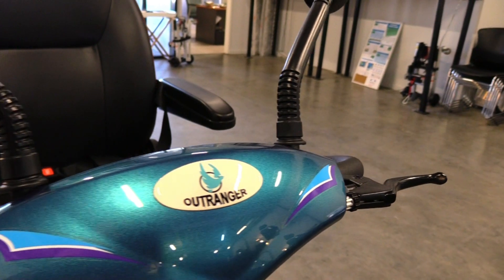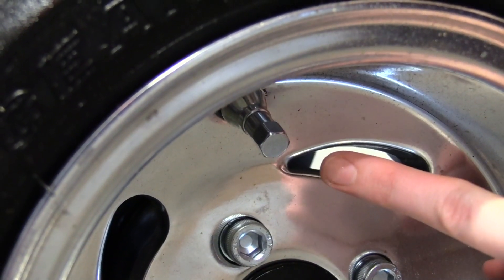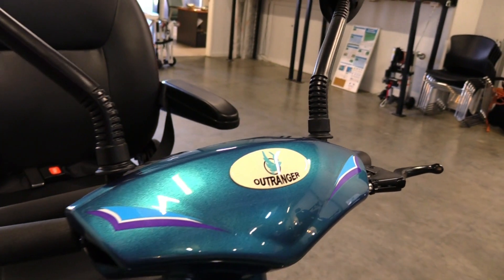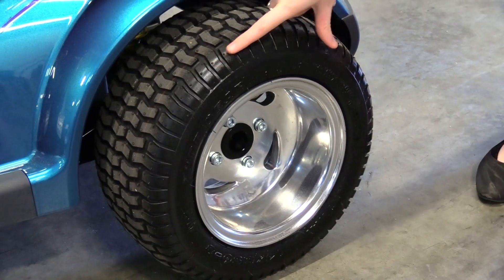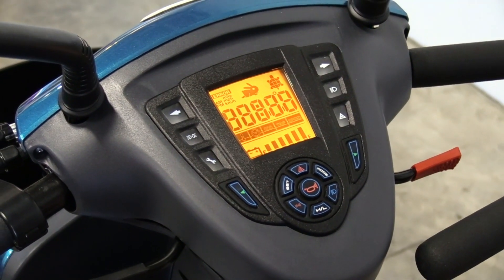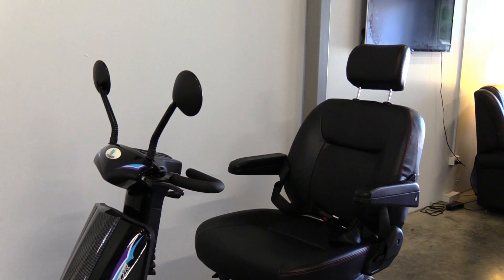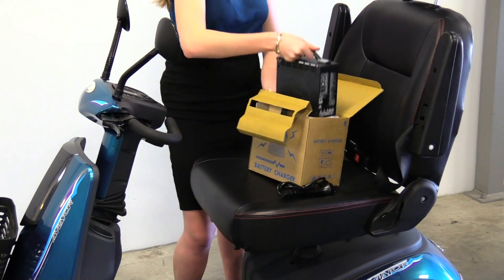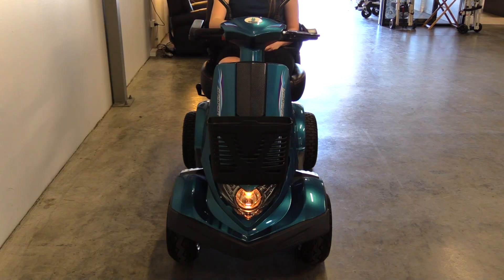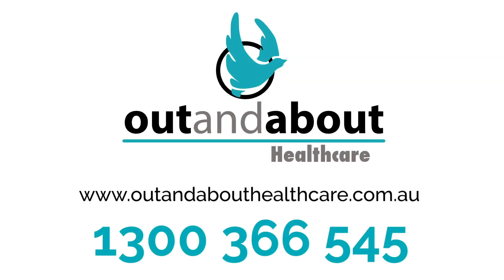It is important to correctly maintain your scooter to ensure it lasts. We recommend routine checks to ensure everything is performing adequately, including checking the condition of your tyres and ensuring your battery is appropriately charged before each use. Every 6 months, we recommend booking in a routine service for your scooter to replace the motor brushes and ensure your Aviator is in optimal driving condition. If you have any questions about your new Aviator, refer to the manual or contact Out and About Healthcare on 1300 366 545.